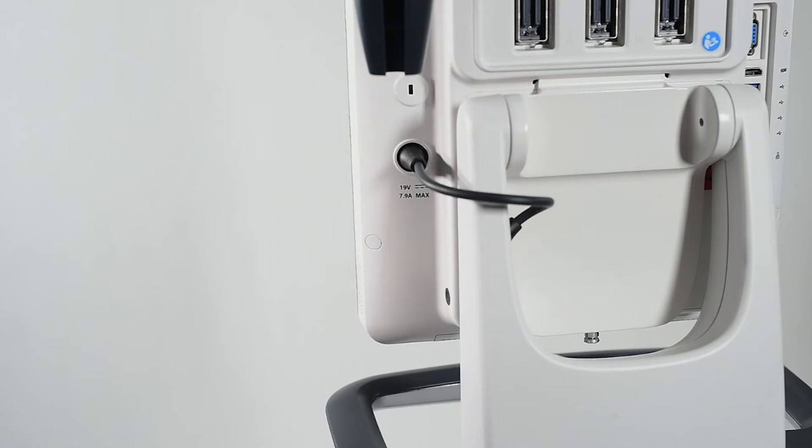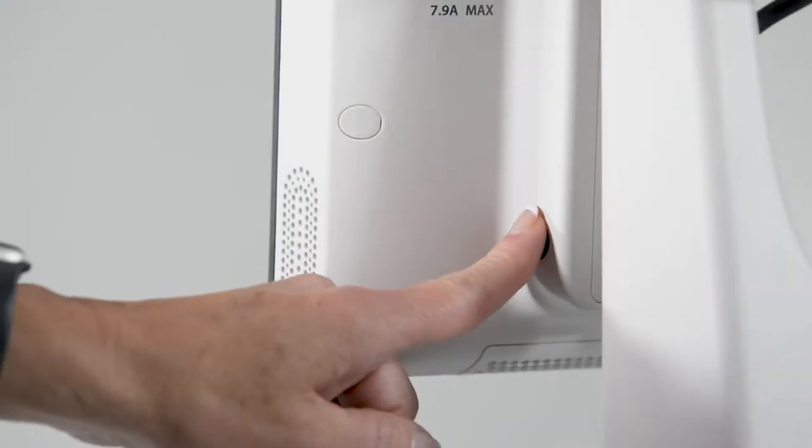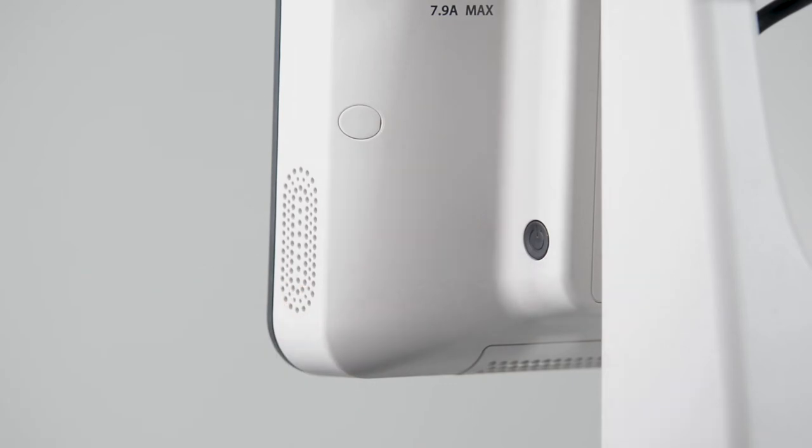The system power button is located at the bottom of the right side of the monitor. Once pushed, the system takes less than 30 seconds to boot up.